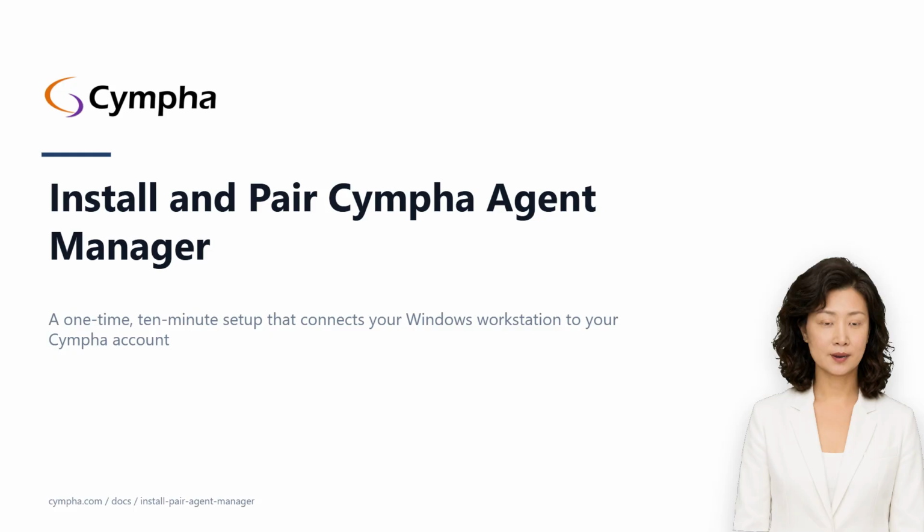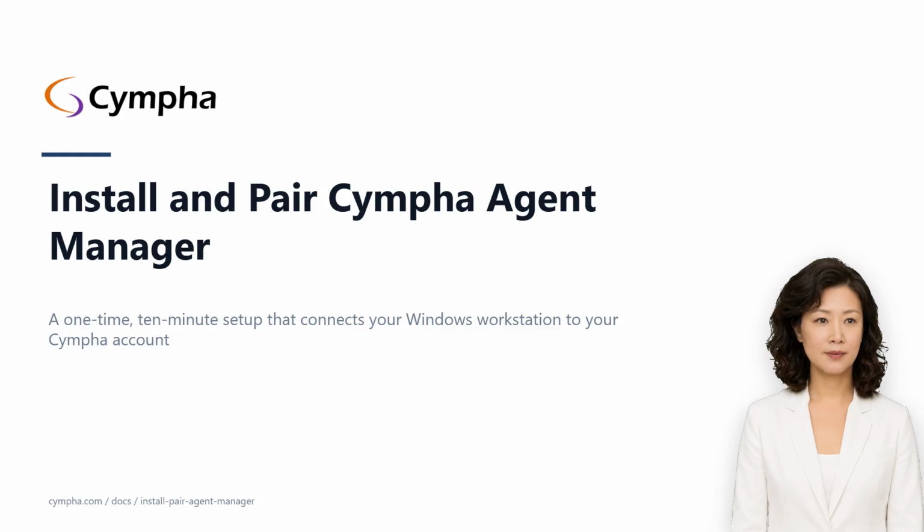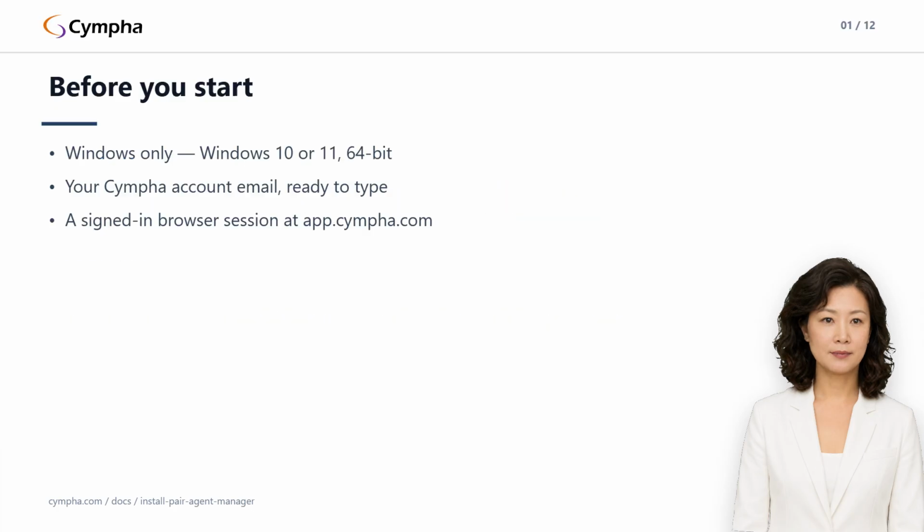3 checks before you download anything. First, the platform. The agent is Windows only, Windows 10 or 11, 64-bit. Macs and Linux workstations aren't supported, so if you're on a Mac, your lab manager will need to dedicate a Windows box for AlignerBot work.